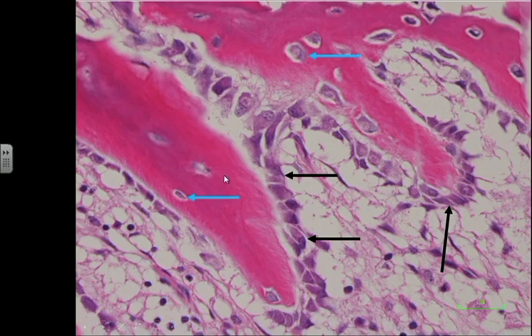We can find that these osteoblasts are almost twins. They are similar in shape and looks, and even in the chromatin staining, the nucleus is staining purple, even the same. And that's what characterizes osteoblasts when they are reactive or in a benign tumor. In a malignant tumor, they will become more blue, and we'll speak about this in the workshop. Osteoblasts are characterized by their function, which is to put osteoid and form bone.